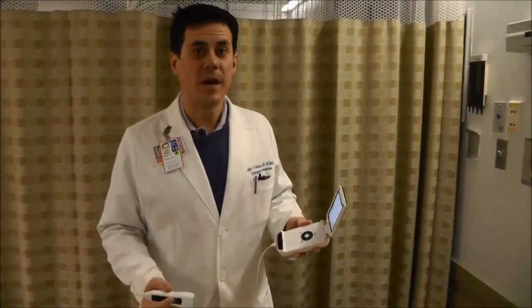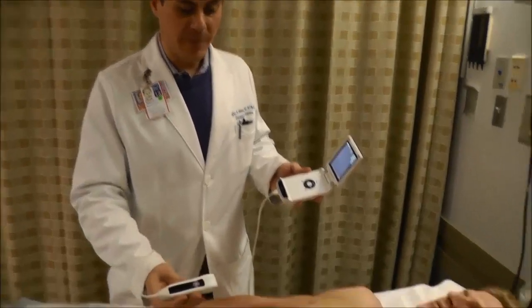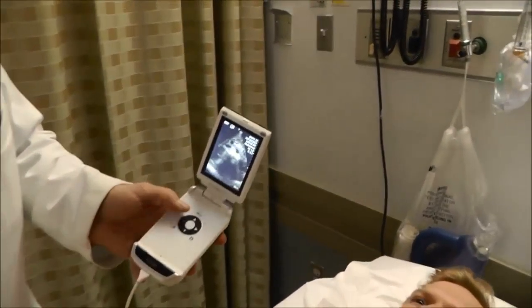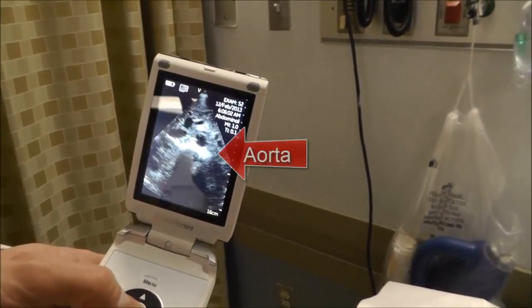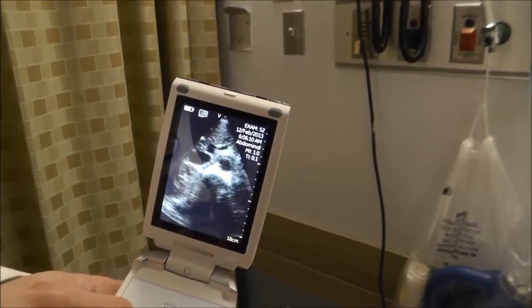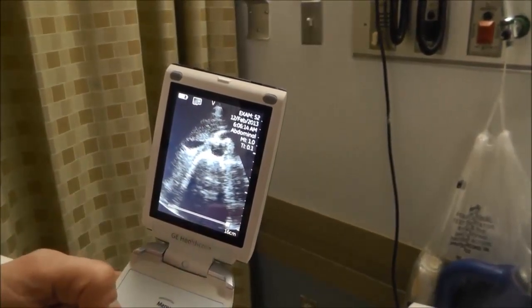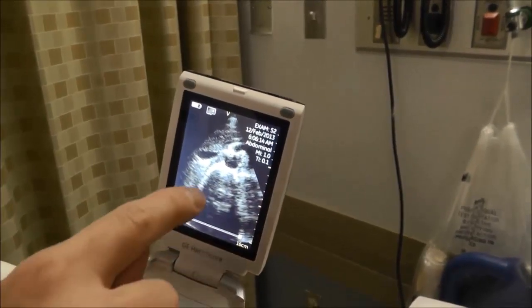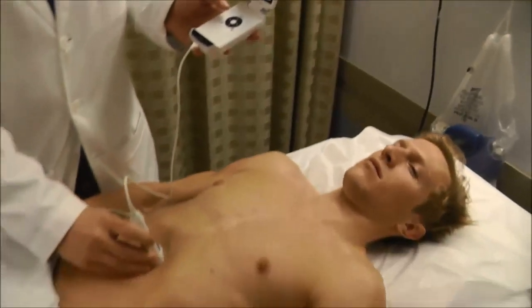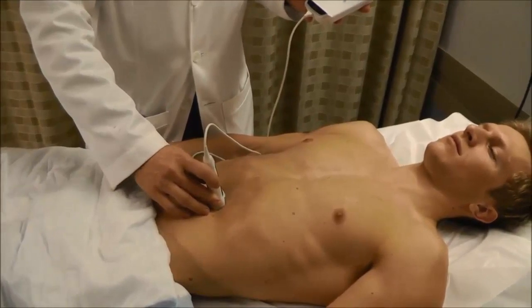To look at the abdominal aorta, we again have the machine in abdomen mode with the probe marker towards the patient's right-hand side. Placing the probe in the epigastrium just below the xiphoid process, we start to see the abdominal aorta towards the right of the screen pulsating, the inferior vena cava to the left with a slightly different pulsatile pattern, and the superior mesenteric artery — a tiny structure just on top of the aorta. Beneath that, the vertebral body casts a shadow beneath its bright hyperechoic anterior margin. We follow the abdominal aorta distally from the xiphoid process down to the umbilicus, which is the level of the aortic bifurcation.